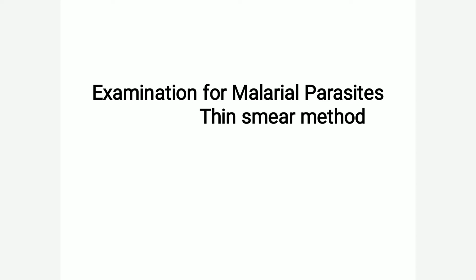Although many pathogenic parasites can be grown in laboratory cultures, this method is not suitable for routine diagnosis because of its relative insensitivity and the delay it takes.